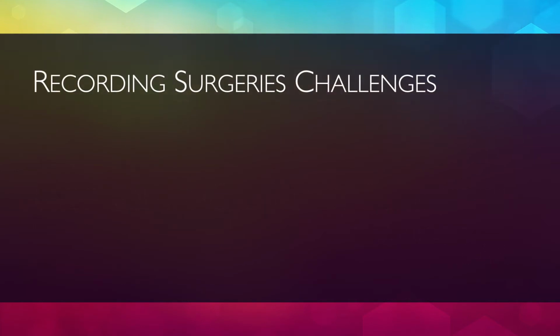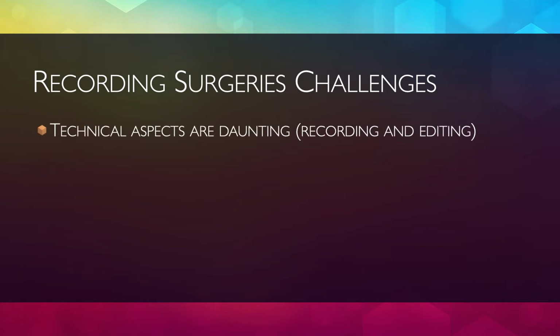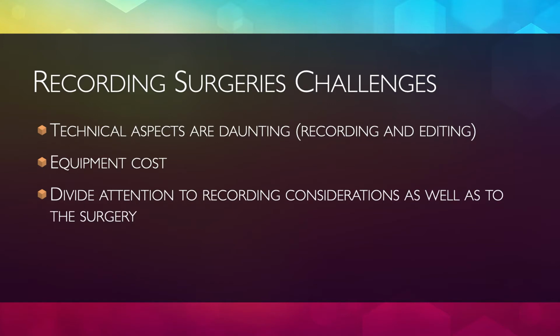Recording surgeries is a most challenging task for many reasons. Aspects regarding equipment and technical knowledge can be daunting, as most microscopes do not come with a complete video recording system. Equipment cost can be an important issue. The surgeon is burdened with the additional task of the recording demands on top of the surgery itself, as well as all the video editing and data managing. Adequate preparation is necessary.